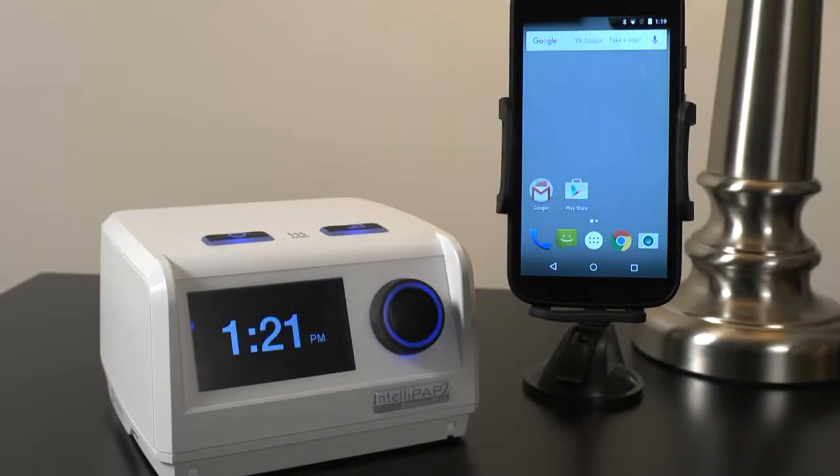The IntelliPAP2 system can connect wirelessly by Bluetooth to your Android device for use with the DeVilbiss SmartLink app. You will want to ensure Bluetooth is turned on for easy connection.